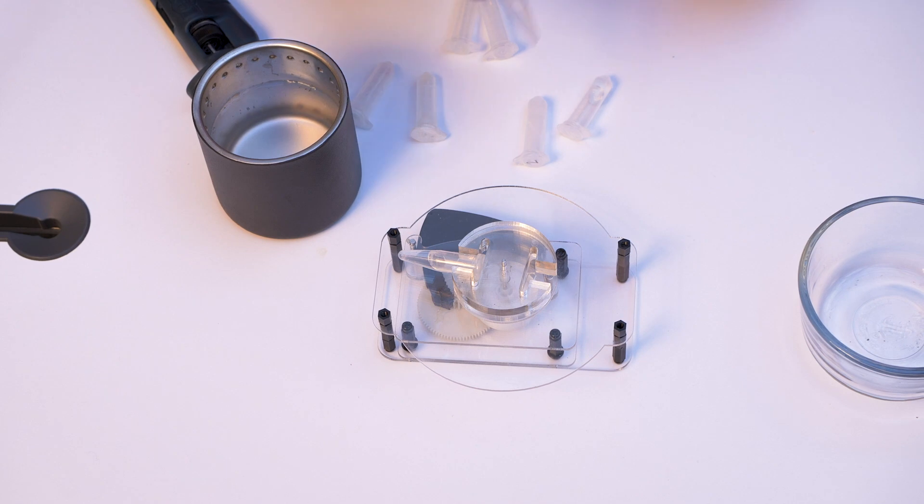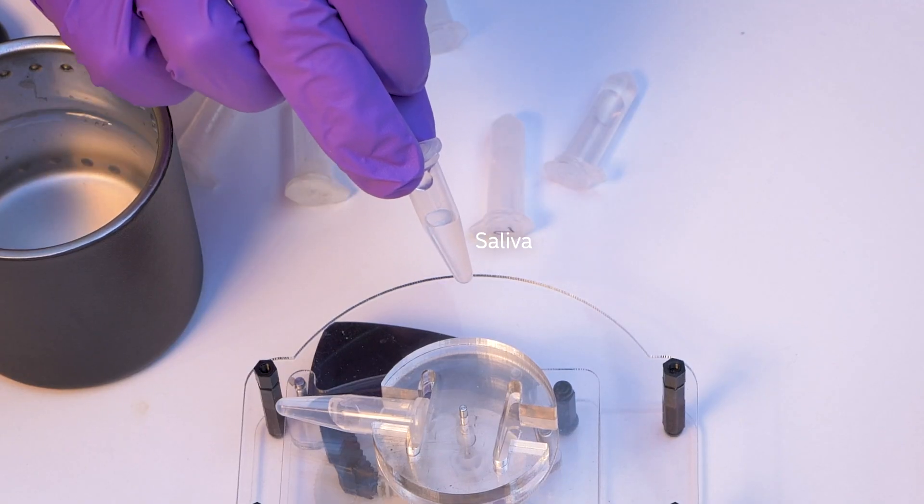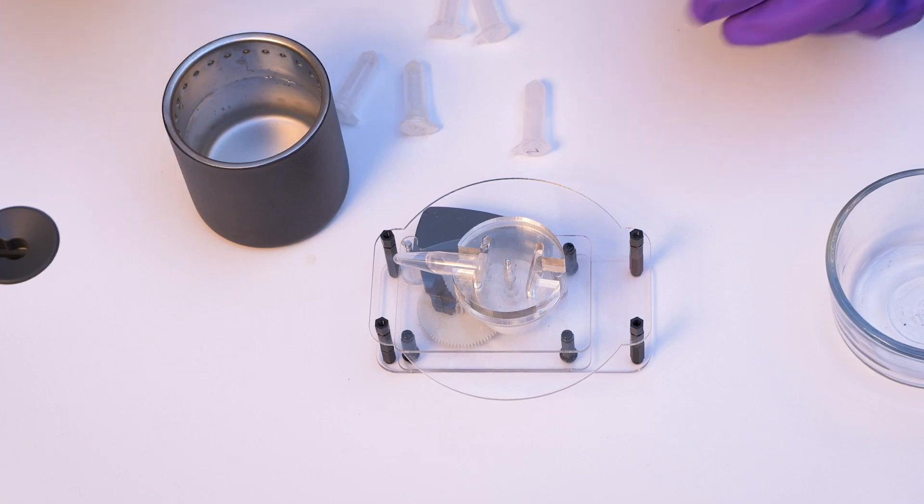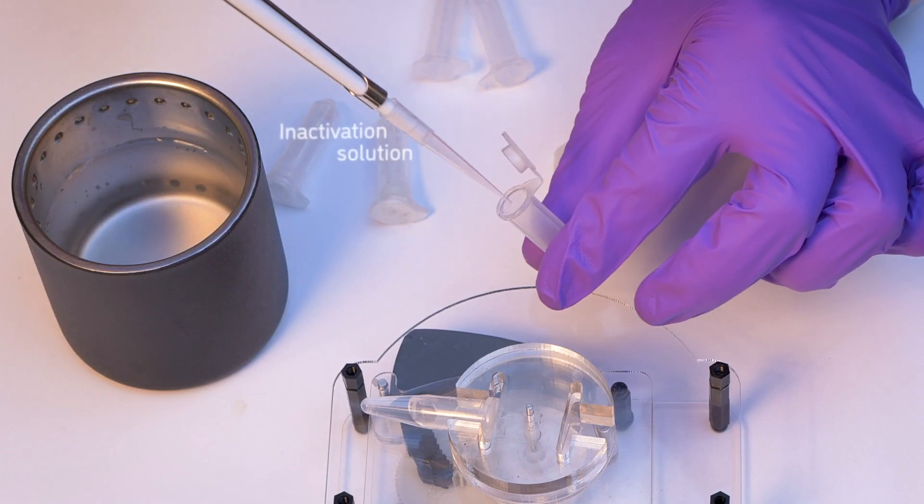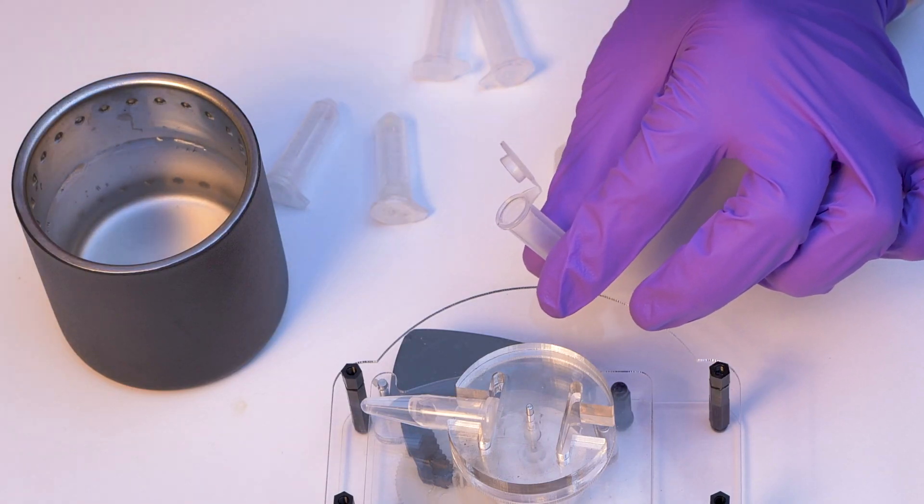The assay starts with collecting saliva. So we collect about half a milliliter. And after that, what we need to do is inactivate the saliva. So we have this inactivation solution. And this will do two things.